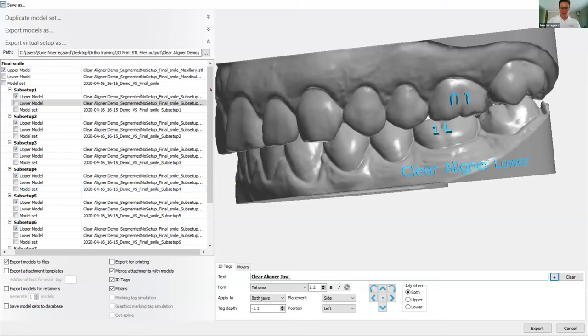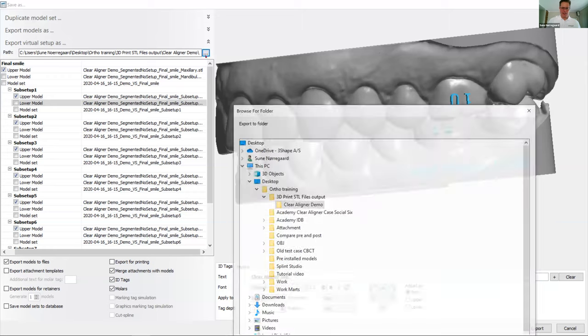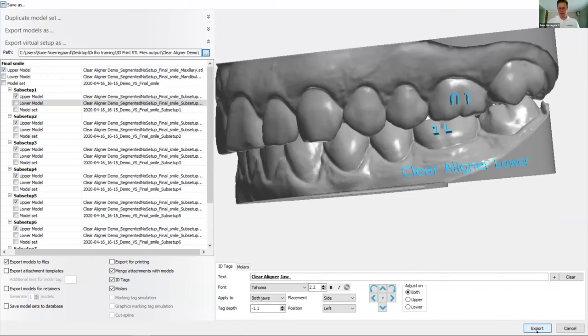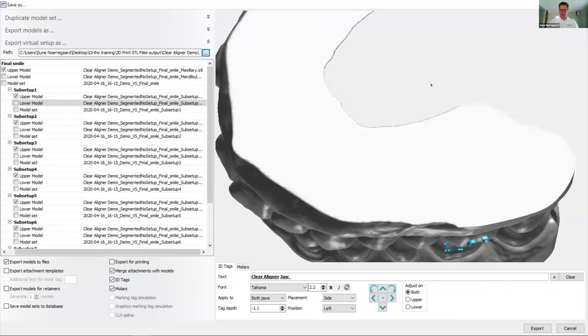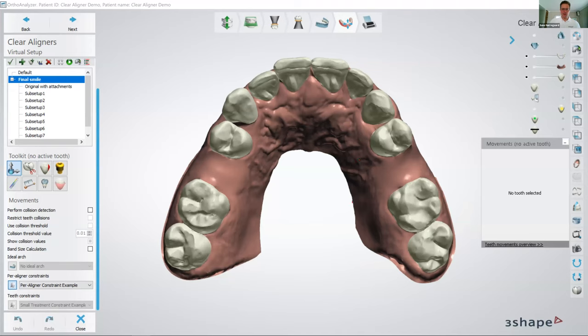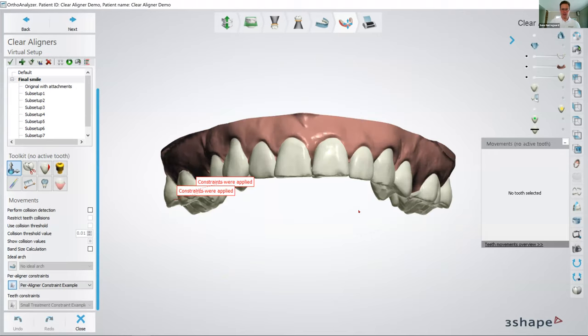So basically all that I need to do is just select the folder or the path where I want to export it. You can export it to your desktop, or you can export it into the folder of your 3D printer or where you have the preform software. And then you click the export, and then all the models, these horseshoe-shaped models, will be sent into that software. And that is, in a very short time, a brief introduction on how you move teeth with the 3Shape ortho software.